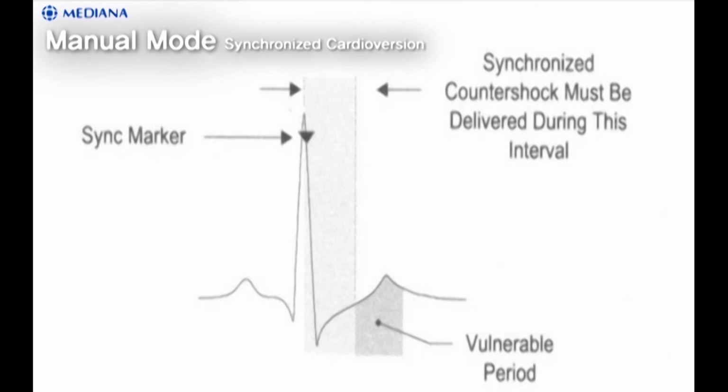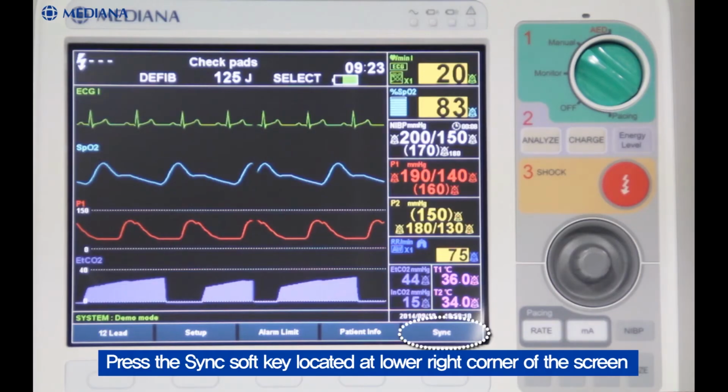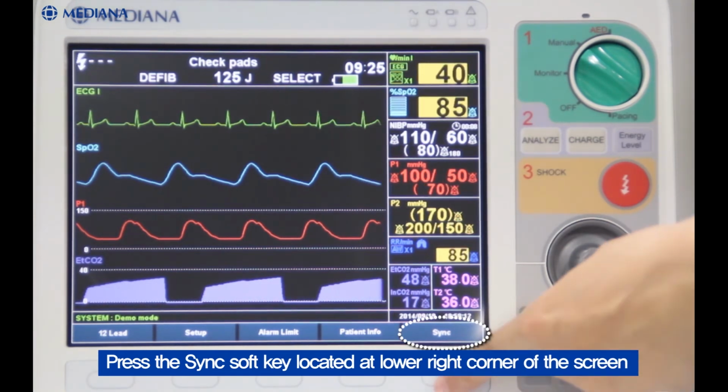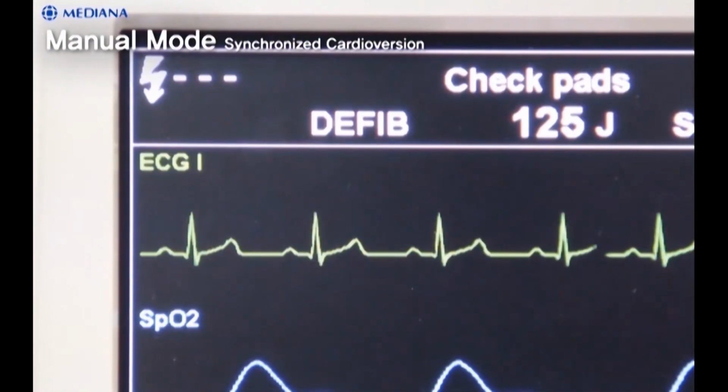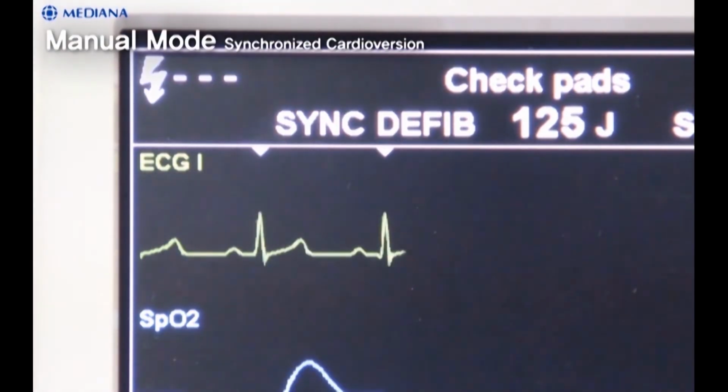Next, let's see how to use the synchronized cardioversion, also known as sync mode. The shock delivery is more efficient when it occurs when the patient's ECG wave is passing the R wave. The sync mode allows synchronizing the delivery of the shock with the R wave of the ECG being monitored in wave sector 1. If you want to activate sync mode, press the sync soft key located at the lower right corner of the screen. You can confirm that the sync marker appears with each R wave.